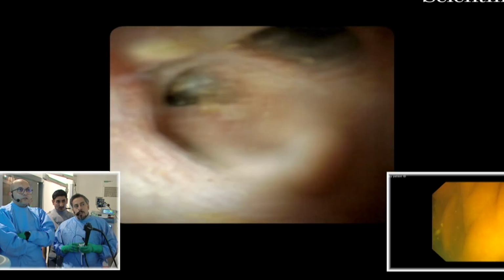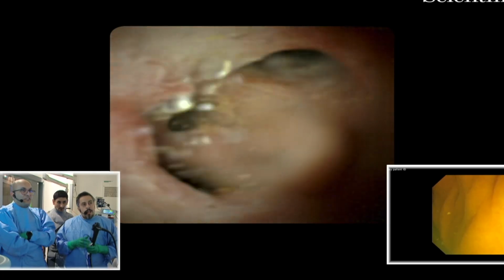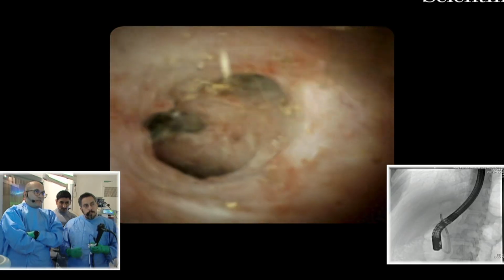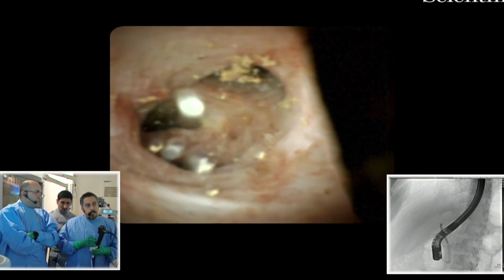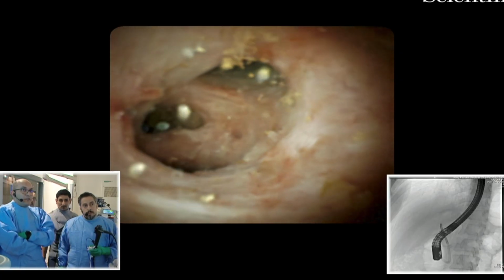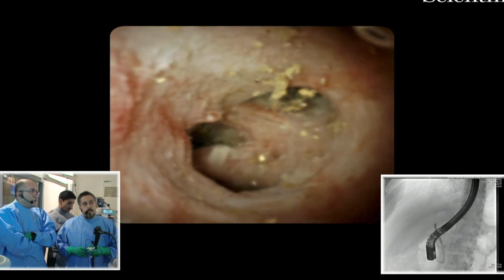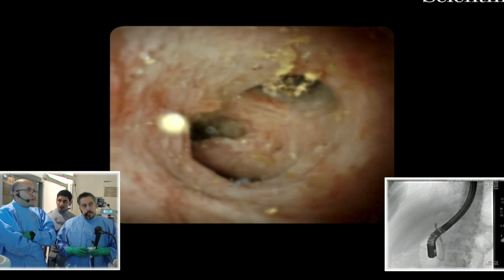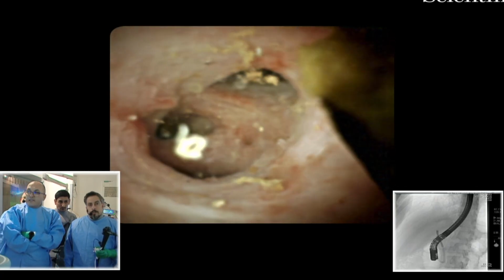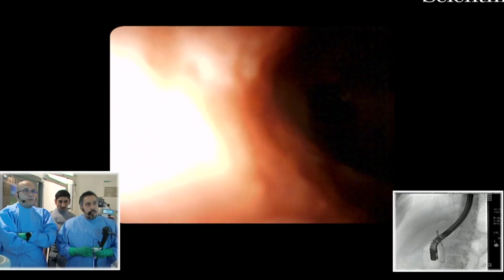So the question now is, do you always put a stent post-cholangioscopy? Yes, I think so. We should protect against cholangitis, and also avoid any residual small stones or any small fragments not impacted. So now we will try to extract these stones by balloon sweeping, with multiple sessions, and finally we will try to do an occlusion cholangiogram to see if there is any definite residual or if it's clear. Do you agree, Dr. Bush? I agree. Any questions from the audience?